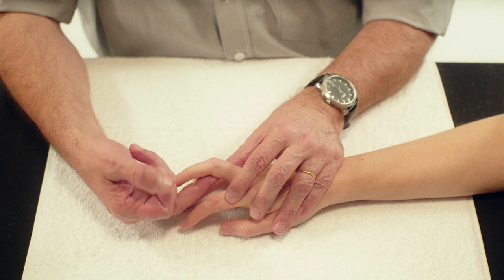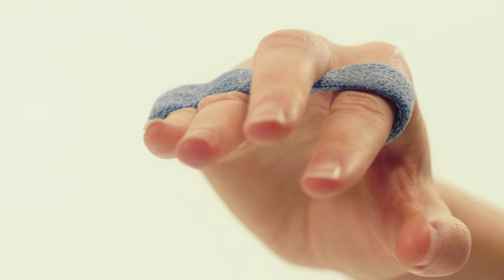Yoke Orthosis Middle Finger. Here we will demonstrate a yoke orthosis for the middle finger.